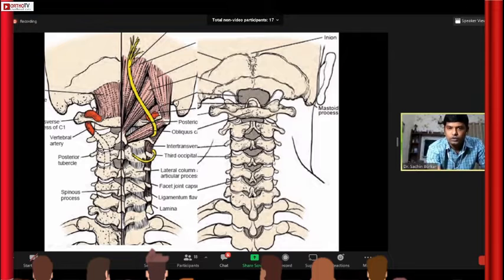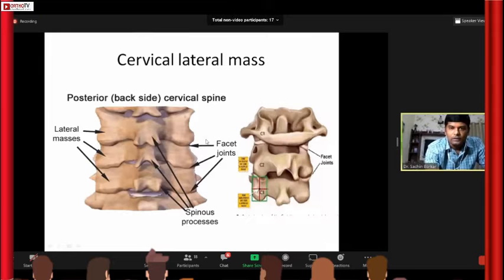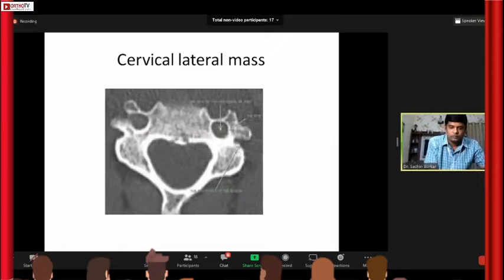So this is actually the lateral mass. So coming to the next slide, this is the facet joint. This is all the lateral mass, this quadrangular bone, because this quadrangle has to be defined anatomically when we are exposing posteriorly, because we have to divide this into 4 quadrants to safely put the lateral mass screw. Then this is the axial cut which I was telling.